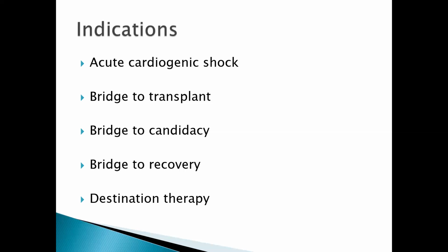But for destination therapy, patients are on this ventricular assist device indefinitely. These patients are not candidates for transplant, and they will be on this ventricular assist device for life. So these are the indications for which patients may benefit from a ventricular assist device.